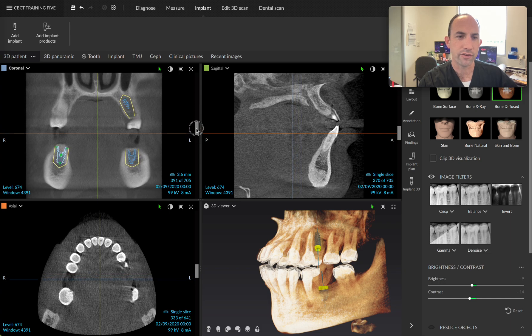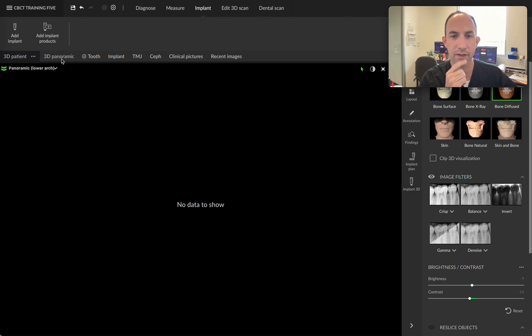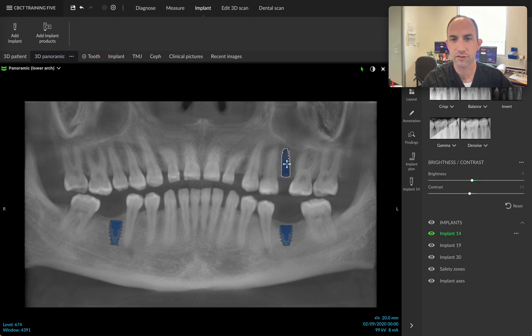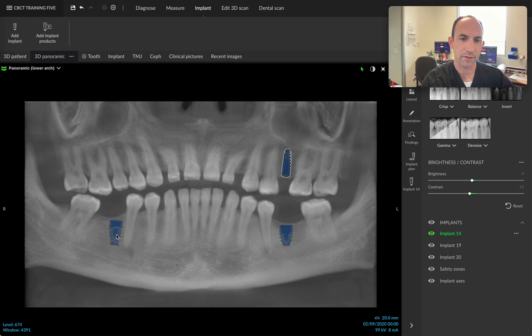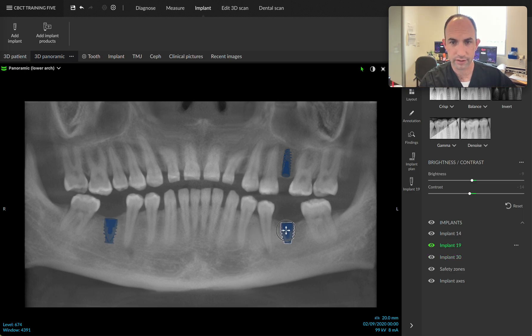I'm going to scroll through and make sure I like roughly where those are positioned. Then I can go back to that 3D pano — they should look very similar. Now this looks like it's a little too close to tooth number 12, so let's drag that distally just a smidge. We have an undercut there, so we're going to rotate that. Same thing here — that's way too close, so we're going to slide that over. Sometimes as you move them around in other views, it'll also change the orientation mesial-distally.